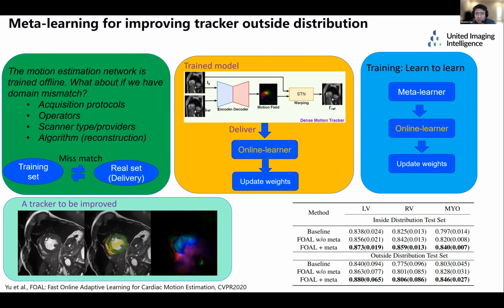It is similar to MAML, but what we do is utilize a meta-learner, and we train the online learner offline, just to mimic the online model adaptation.